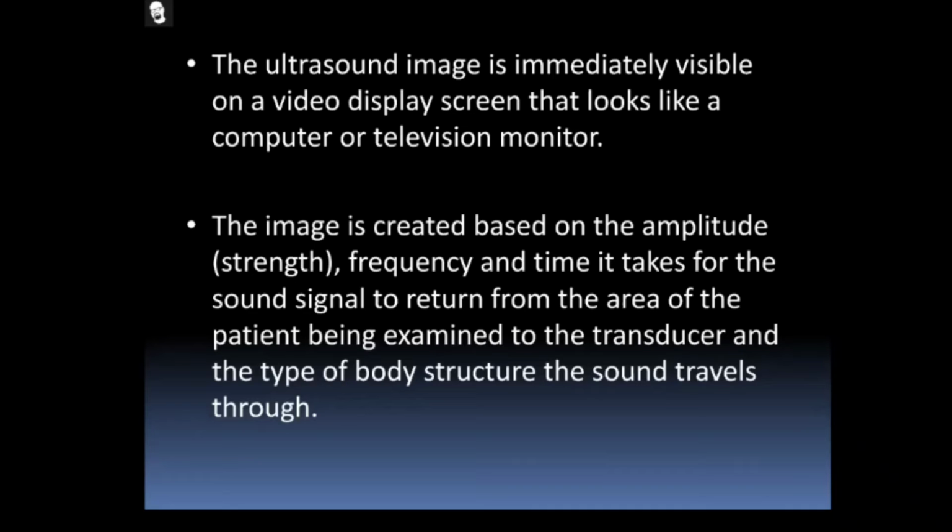Okay, and then the next point, I read out the same point again. The ultrasound image is immediately visible on a video display screen that looks like a computer or television monitor. The image is created based on the amplitude, frequency and time it takes for the sound signal to return from the area of the patient being examined to the transducer, and the type of body structure the sound travels through. That is a very important thing.